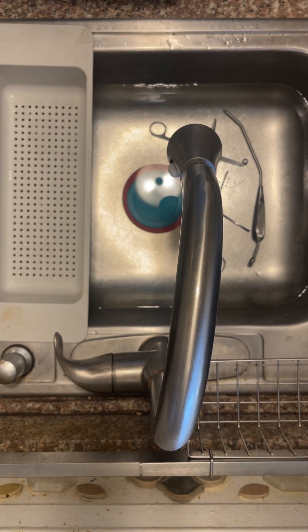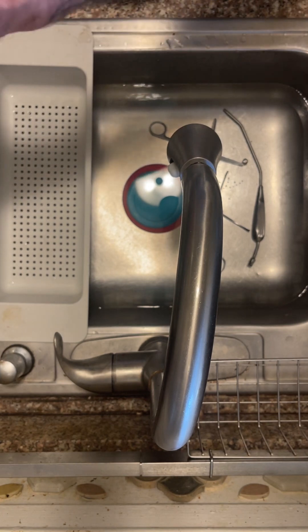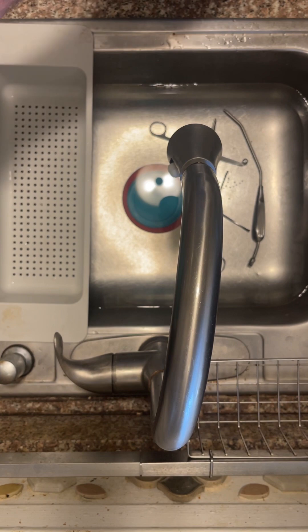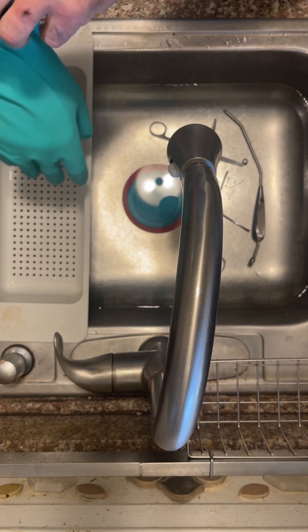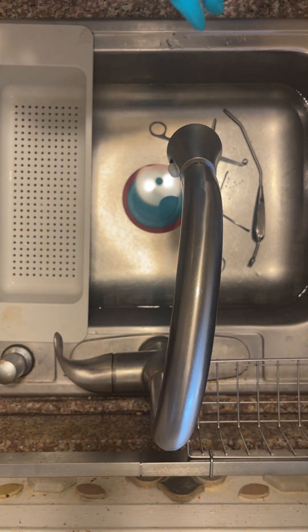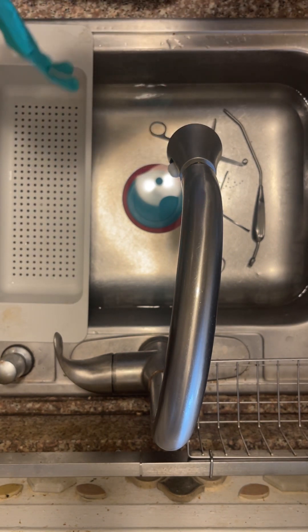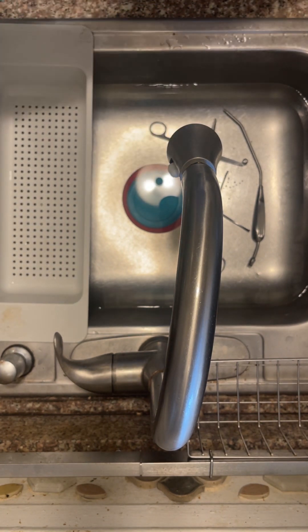When it comes to decontamination of materials, it usually begins at the point of use. Once items start to have gross soil removed, they come down to the decontamination area, which would normally have three sinks — but as we only have one sink, that is all we can use at the moment.